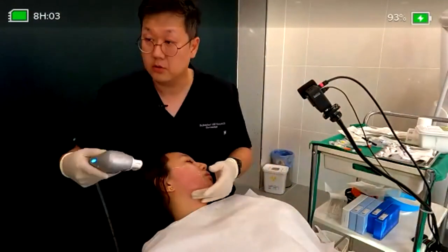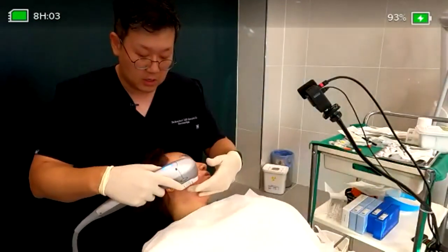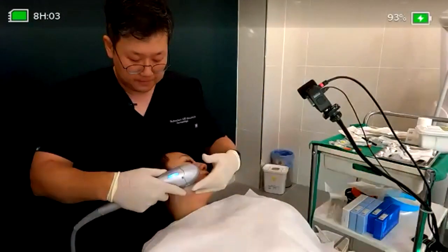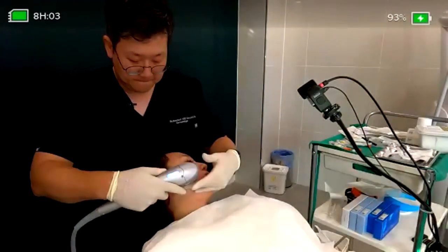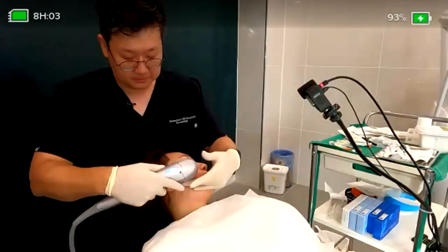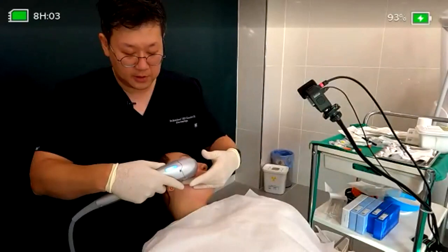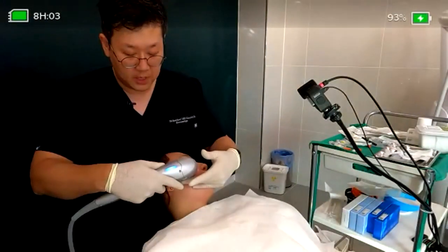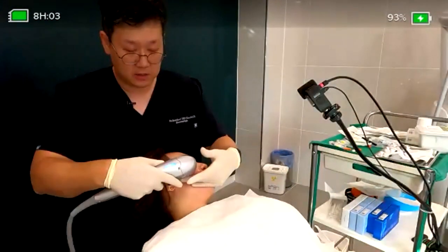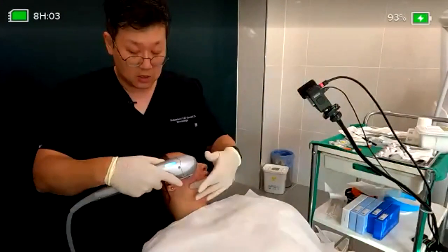Okay, so we reach around 60 to 70 lines here, and we will go to the lattice treatment here. Once again, if you are starting your practice, if you are not confident with your hand movement or if you're tired, maybe you can count how many lines you make in a certain distance.